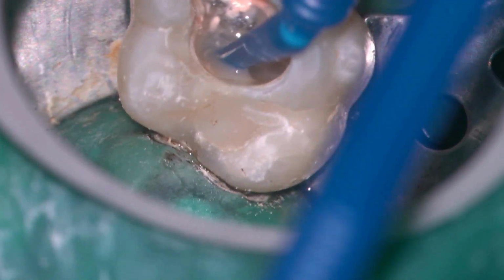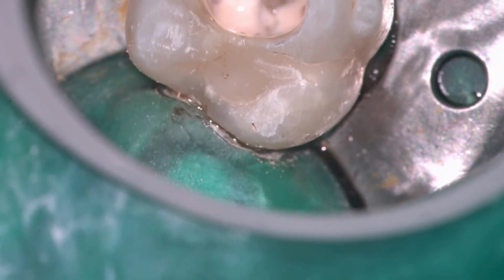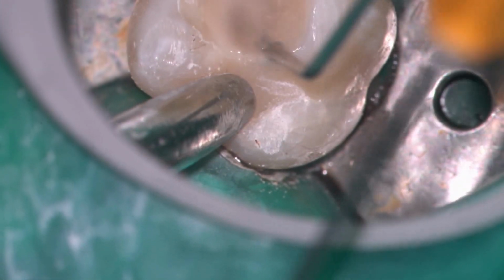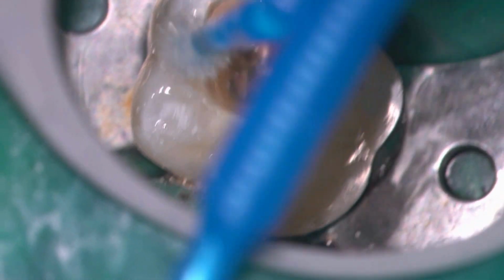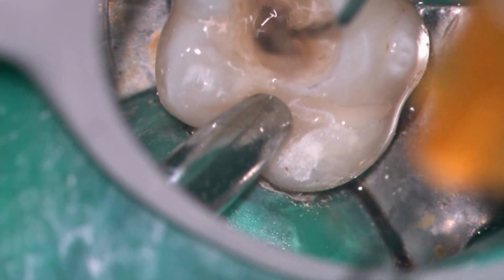Here you will note I've flooded the pulp chamber with chloroform, and we're going to wipe away the excess gutta percha by solubilizing it and cleaning up the walls with a small micro brush. And then as we do that, we'll rinse with alcohol and scrub that to remove the excess gutta percha. So we'll just clear up the periphery, clearing it with the alcohol.